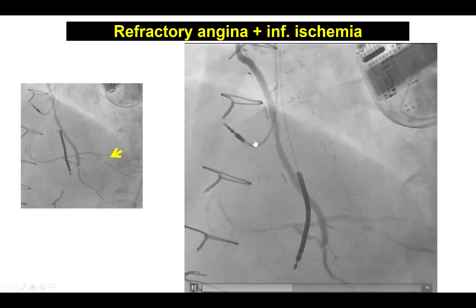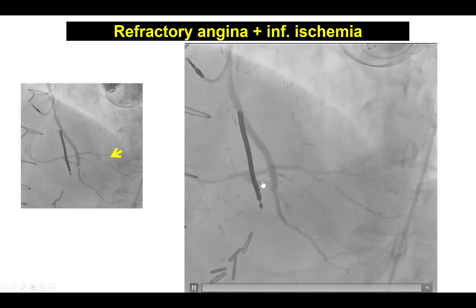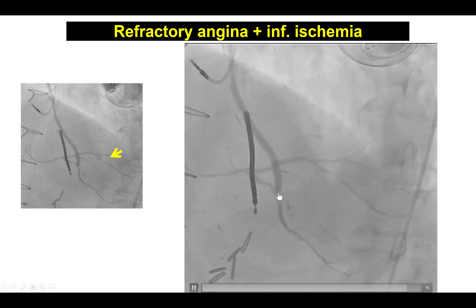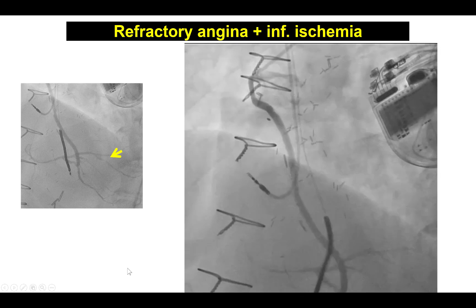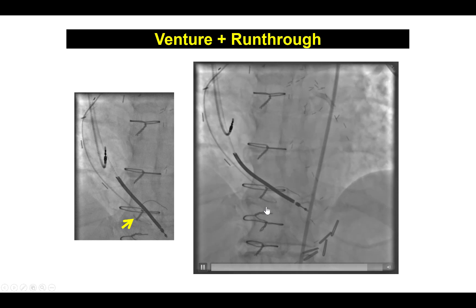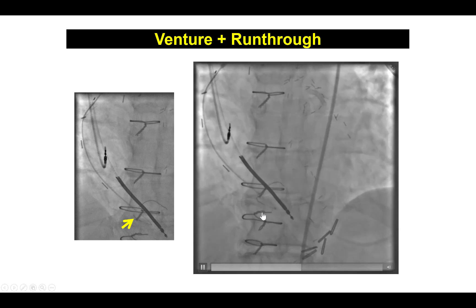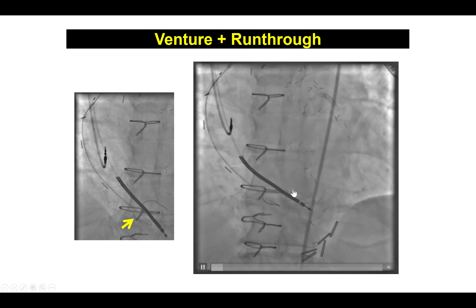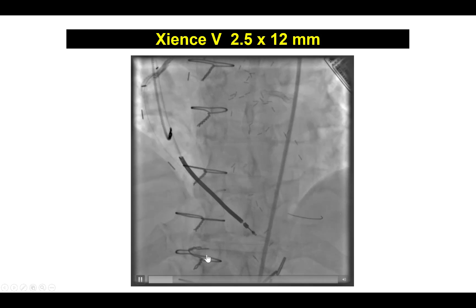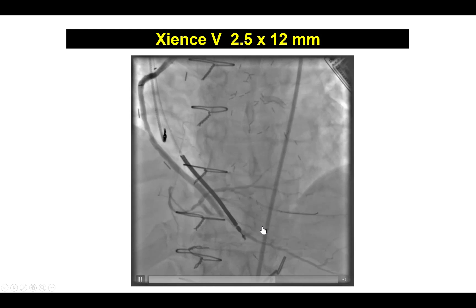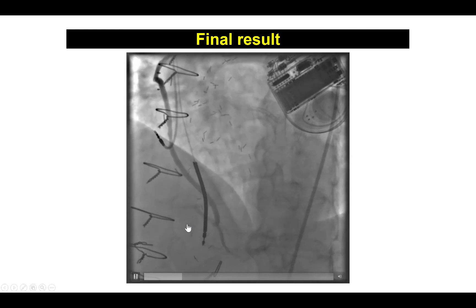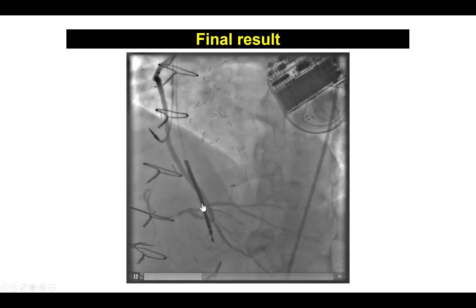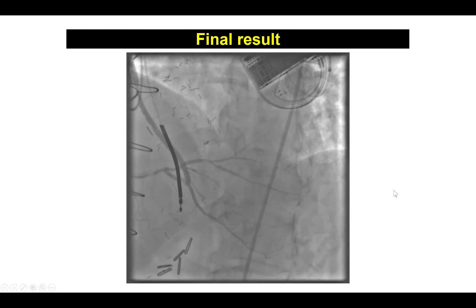This is an example of a patient with a previous bypass and a vein graft to the PDA, with a target lesion all the way to the right posterolateral branch — requiring navigation through three bends. This was accomplished by advancing the Venture catheter retrograde into the PDA, then negotiating the second turn from the PDA into the right posterolateral, and then successfully wiring the lesion and delivering a stent with a nice result. For bypass grafts, the Venture catheter can provide very good support to wire through tortuosity.